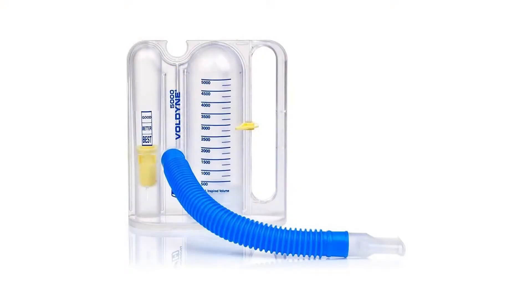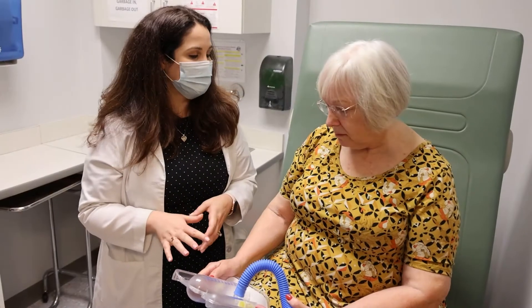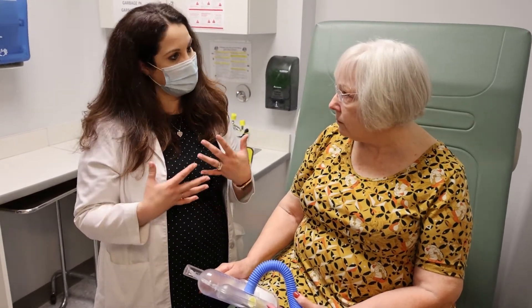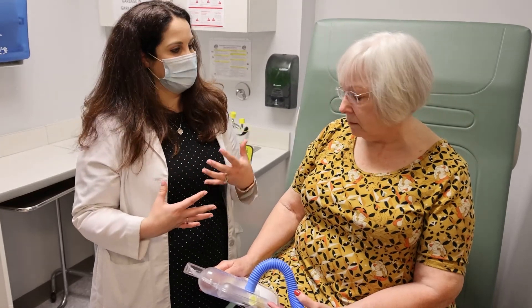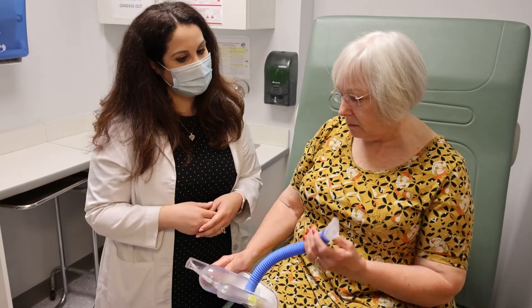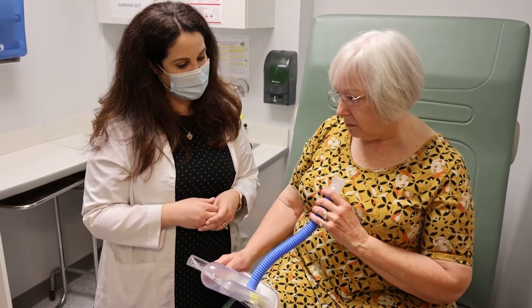This is the incentive spirometer. To use the incentive spirometer, you want to take a deep breath in and exhale all of your air. As soon as you empty your lungs of air, put your mouth on the mouthpiece and take a slow deep breath in.